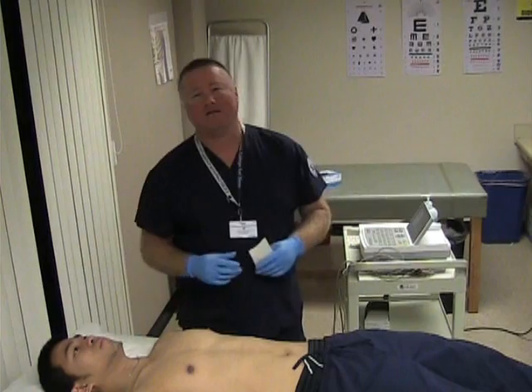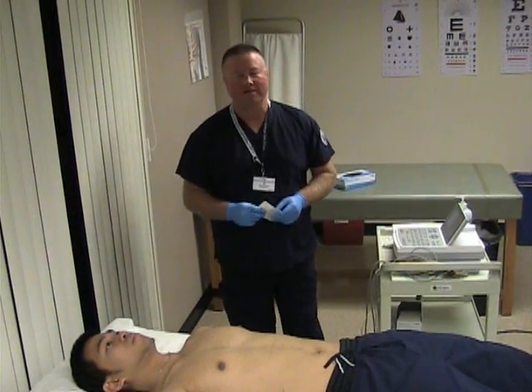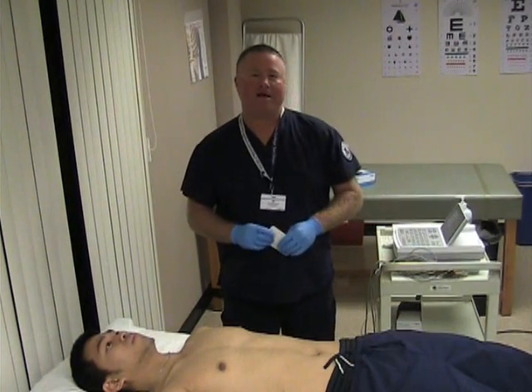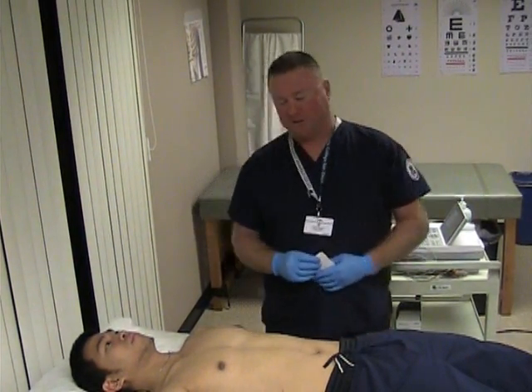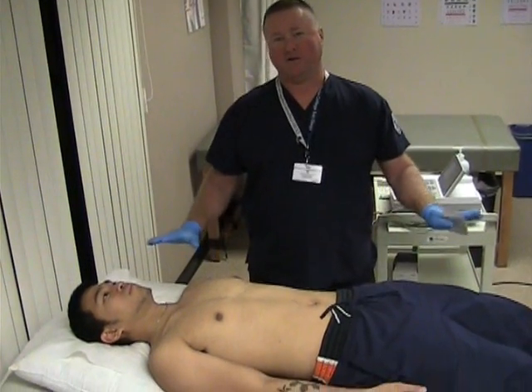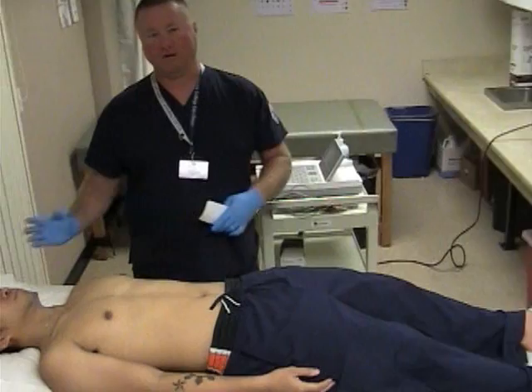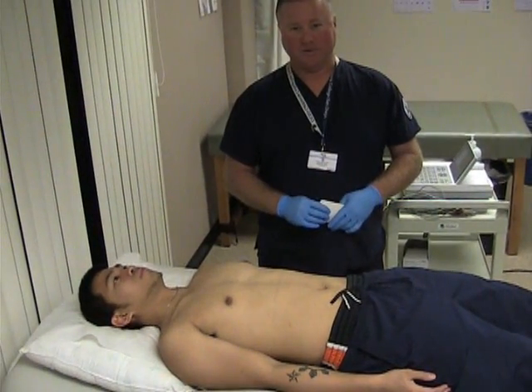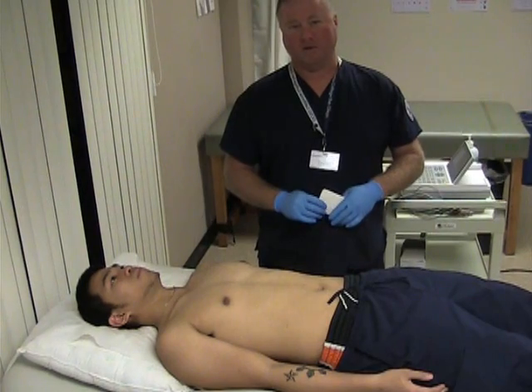Hi, I'm Clarence Scotton and this is CCSD Med 103. Today I'm going to demonstrate how to properly do an EKG. First thing we want to do is position our patient either at a horizontal level or a maximum of a 20-degree upright position. Anything higher will mess up the baseline on the EKG.